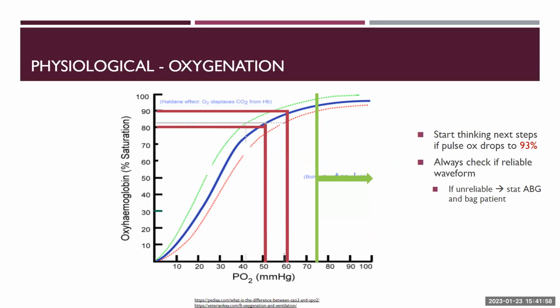Really understanding this graph, when it comes to oxygenation, there is a plateau aspect: between 90 and 100 is still kind of near the same range, but once you drop from 90, you start going really far from the amount of oxygen the patient needs.